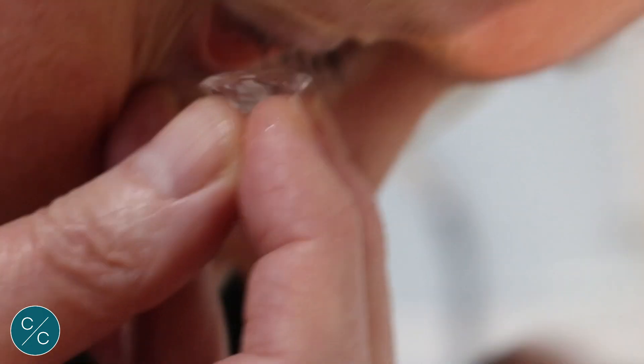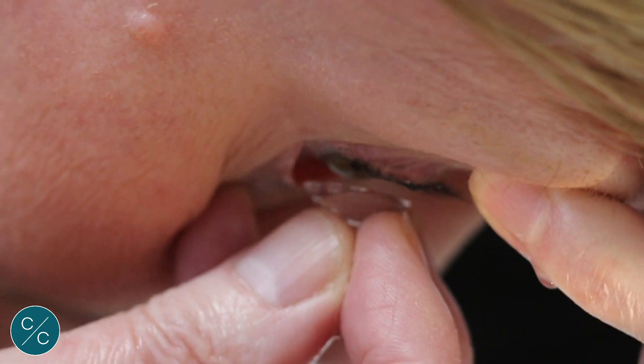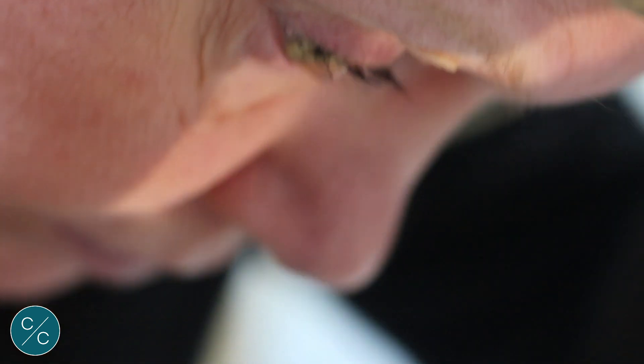So pulling down, lift the top lid, gently press the lens against the cornea — ready for the cold sensation — press firmly and release.